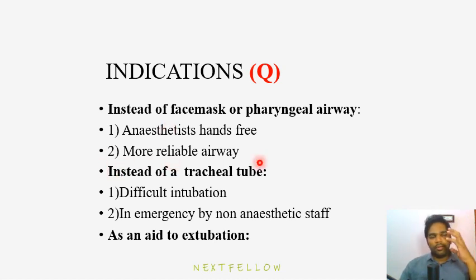Face mask ventilation is not so reliable, because whatever gas you are giving will not all go into the patient's lungs. Some may escape into the atmosphere, some may go into the stomach, but here it is much more reliable. Instead of a tracheal tube, difficult intubation can be avoided in an emergency situation by non-anesthetic staff. It is also an aid to extubation.